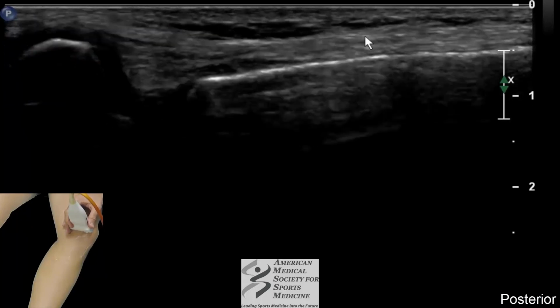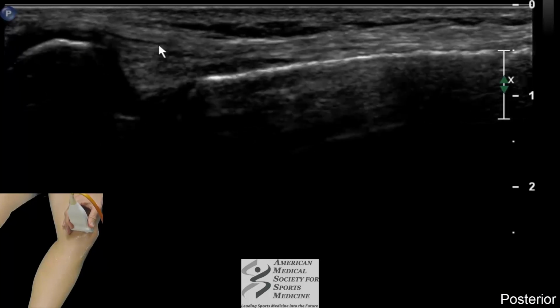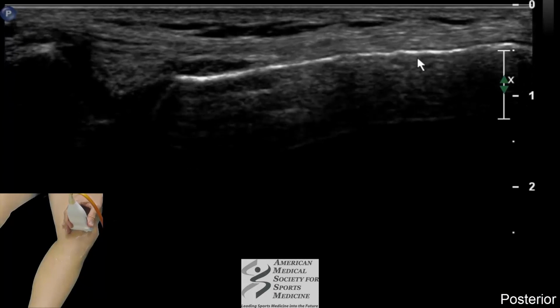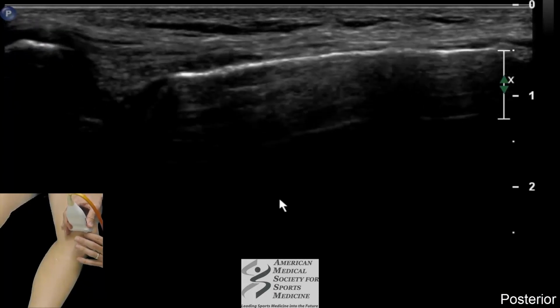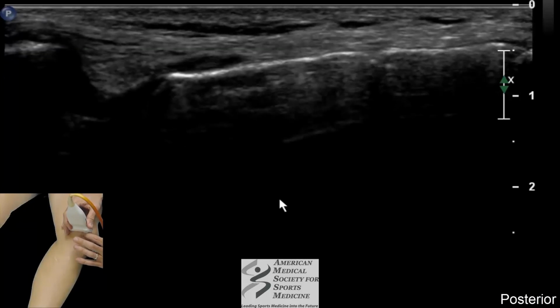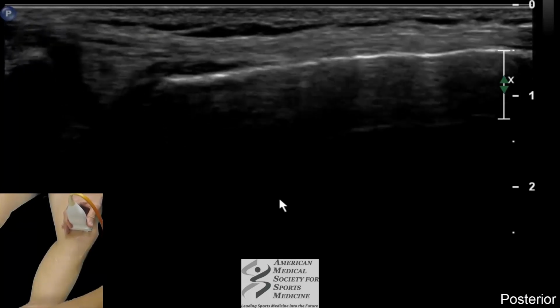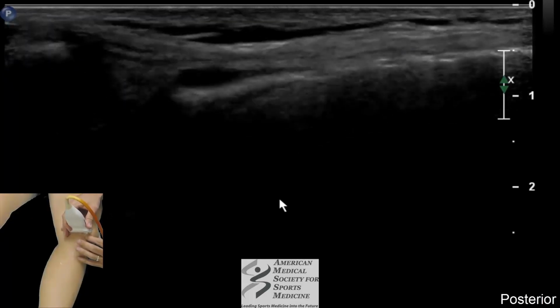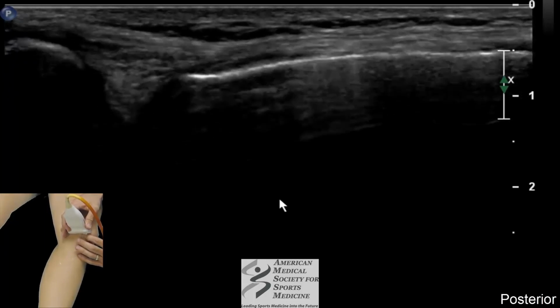So oftentimes it's not as distinct as one may wish, but we can see here this thickening component of the retinaculum that runs over again towards that adductor tubercle. Here you can apply a dynamic stress on the patella, and you can try to glide that over to see if there's any motion within that area. Sometimes bringing the patient into a little bit more extension can make that a little easier for us as we look for any evidence of injury of that area.